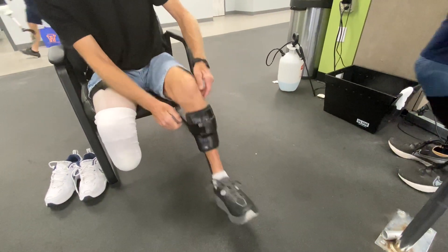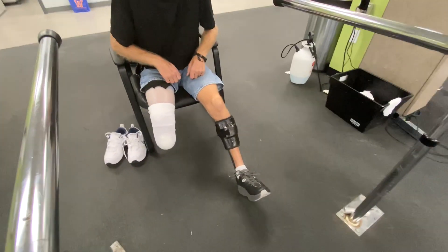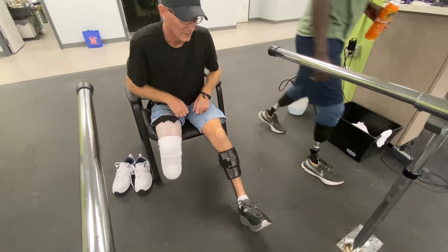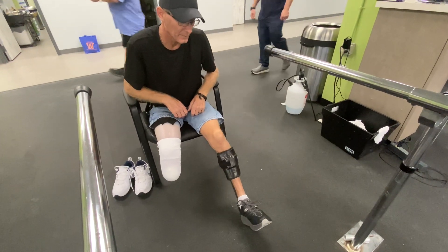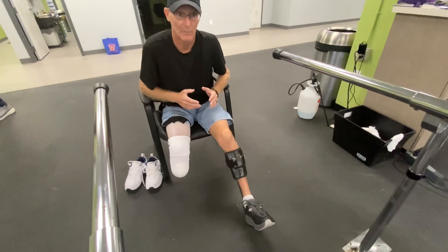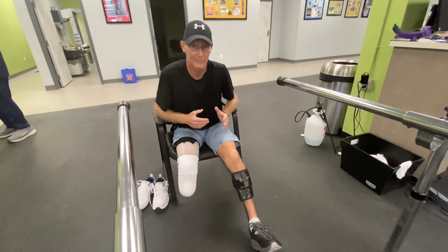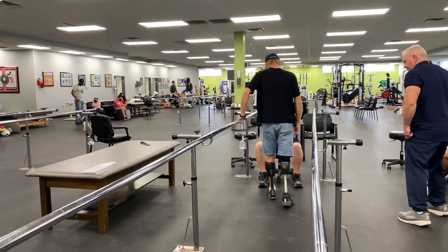Looks good. Is that your first time putting it on? Yeah, it'll take some getting used to. It'll help out quite a bit — without having drop foot and more balance on the toe, without having the toes catching. I'm just letting you get used to it, then I'll watch your prop setting.